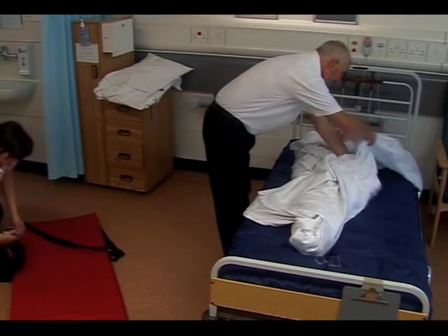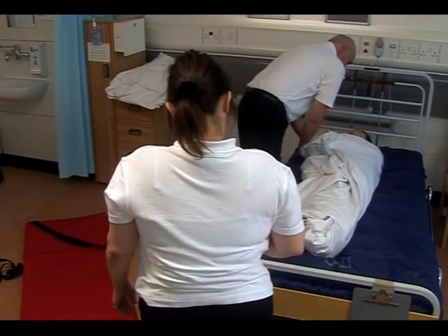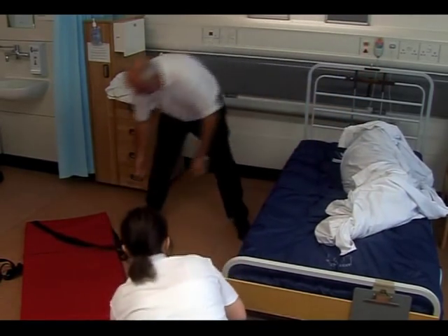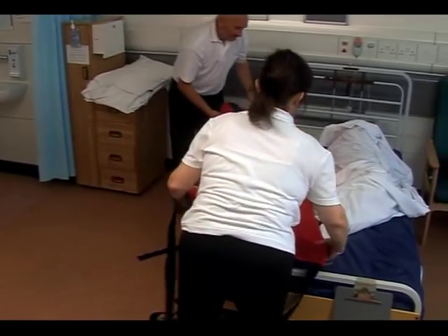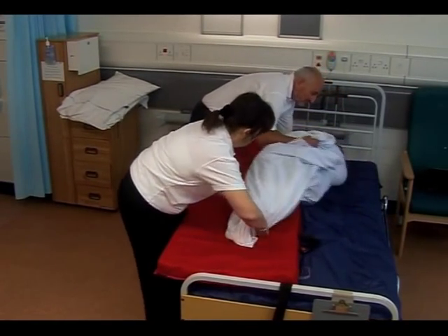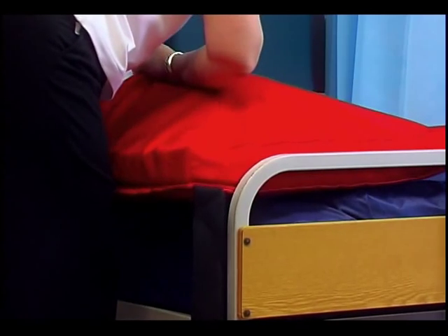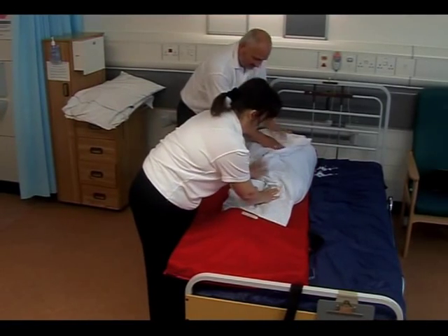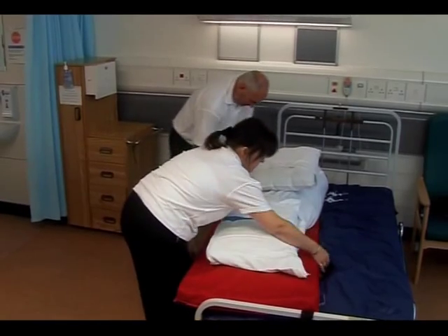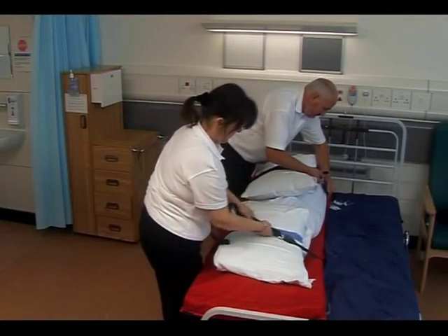When you roll them onto their side, ensure that they are supported if you feel that there is any danger that they may be at risk from rolling off the side of the bed. Carefully place the ski pad at the side of the person in bed and gently roll them back onto the ski pad before placing the feet in the pocket. If additional bedding and pillows are available, use these to further pad the chest and leg areas where the buckles can then be tightly secured. By pulling the buckles as tight as possible, it will help to cocoon the patient or resident and also reduce the amount of friction on the underside of the ski pad.